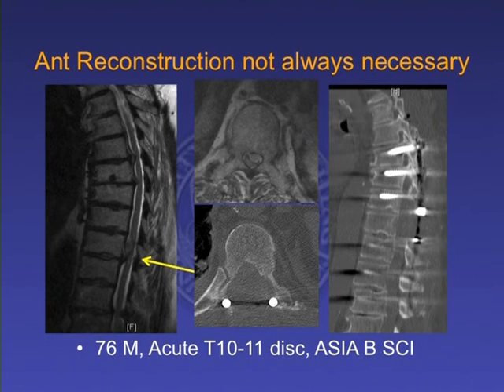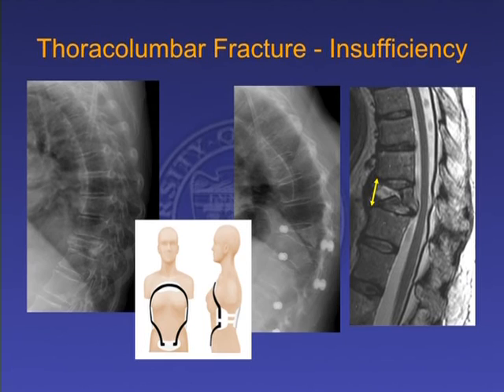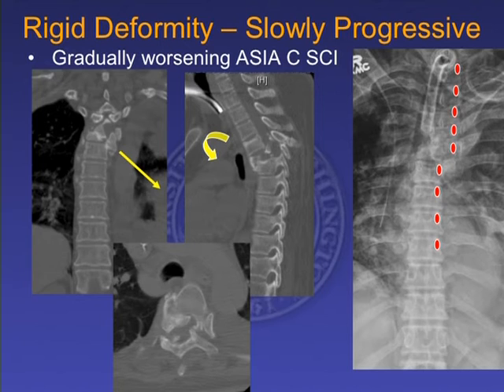And this is a non-tumor example, but that applies to the tumor realm as well, of a gentleman who simply had a disc excision, and we ended up taking down both facets. So we basically still did a posterior instrumentation to stabilize him, but he had no anterior column deficiency. Obviously, a very versatile exposure, vertebral column resections for fixed deformities, as you can see here. This is sort of post-traumatic fixed deformities. The ability to mobilize the spine and reconstruct it like really no other single approach that we have.